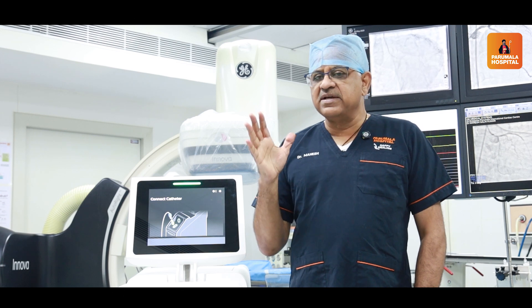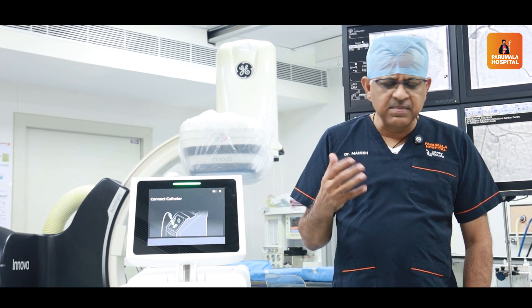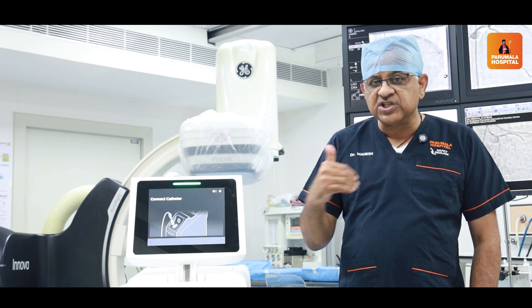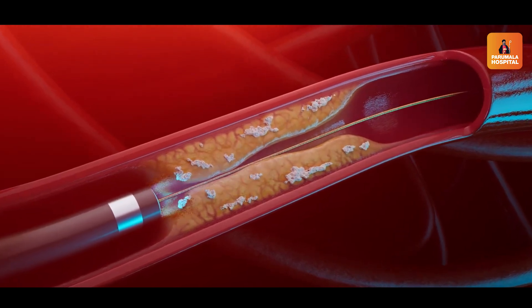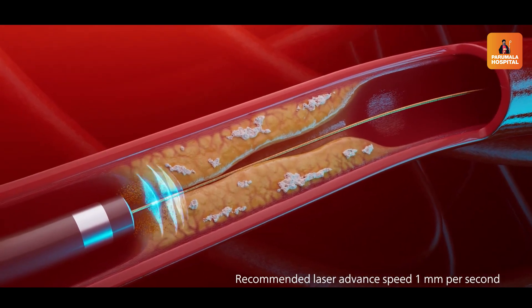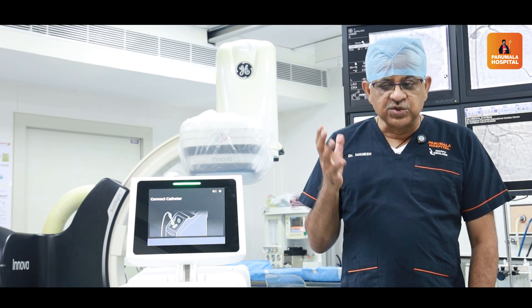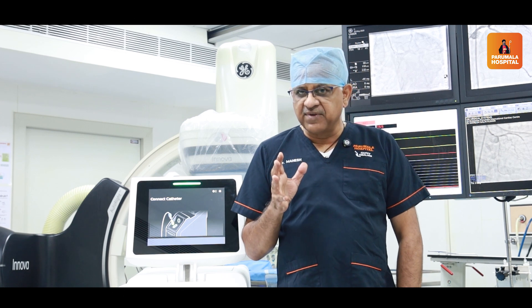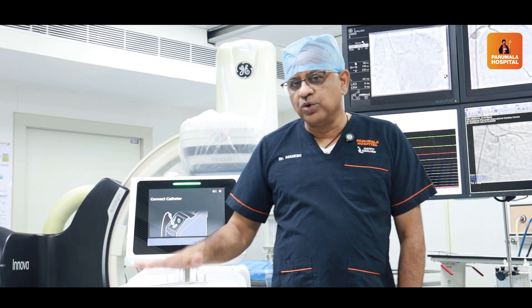The second most common subset is in-stent restenosis (ISR). That is, you have put in a stent earlier, and inside the stent there is a lot of fibrous material which has built up over time due to multiple causes. The only other option here might be bypass surgery, because the ISR area is very difficult to tackle. Laser has become a big blessing — if you laser the area continuously for some time, the fibrous tissue between the stent and the inner part gets damaged and washed out. Beyond that, we can do a cutting balloon, a non-compliant balloon, and perhaps a drug-eluting balloon. Treatment of ISR has become much better with laser because it significantly reduces the fibrous tissue load, helping us to modify it.